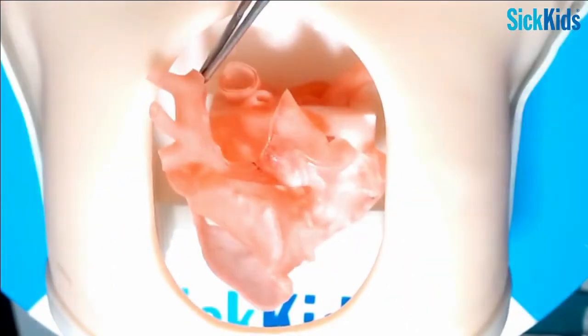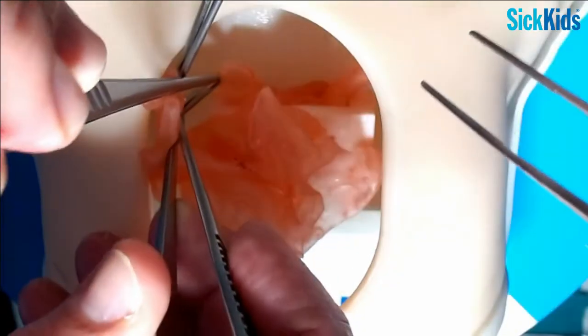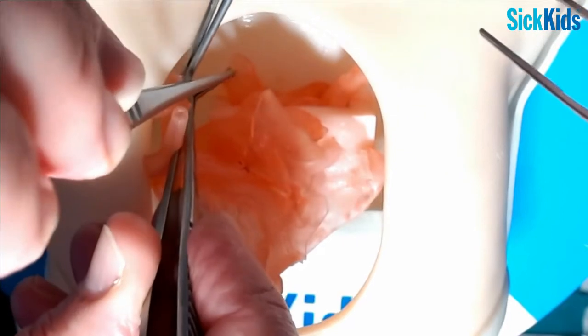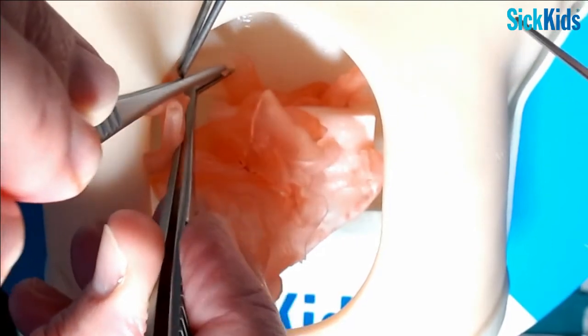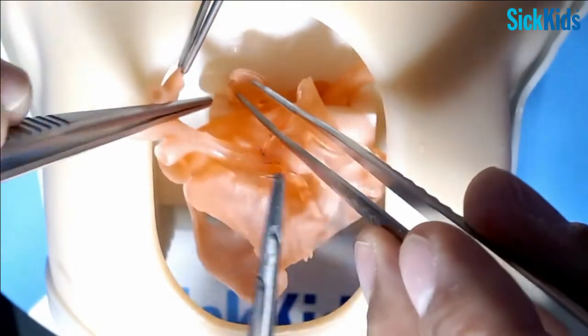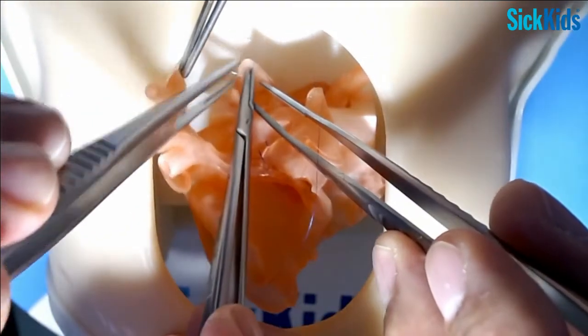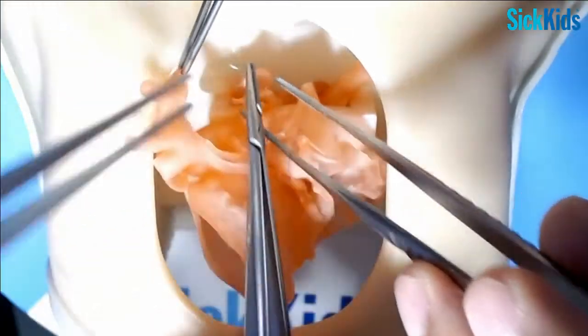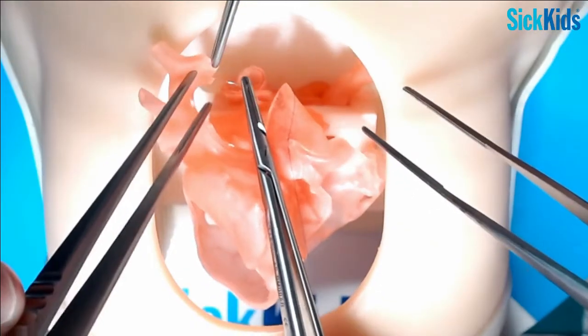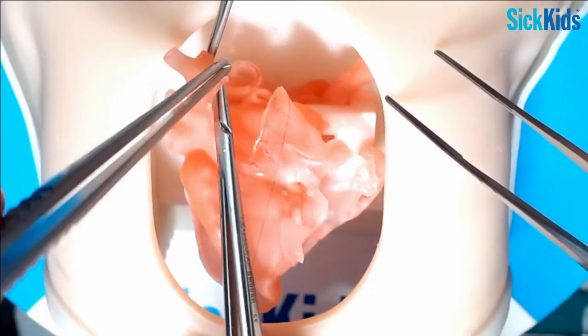Okay, do we have another? Same thing, this stuff collapses, so I'm going to just take a little V out so it can sit in there the way we want. And I'm not going to put all these stitches in, but you start just adjacent to the base. And then usually there's a little corner right here that fits down inside there nicely.